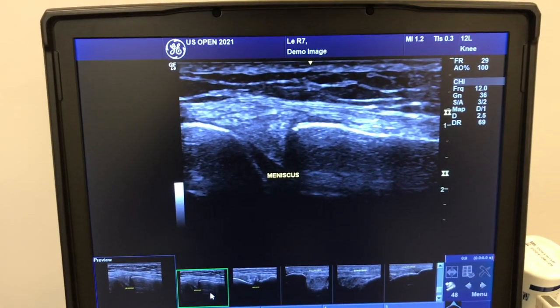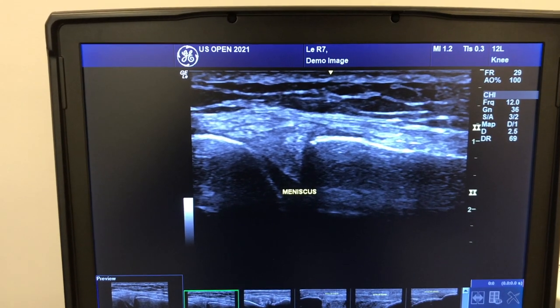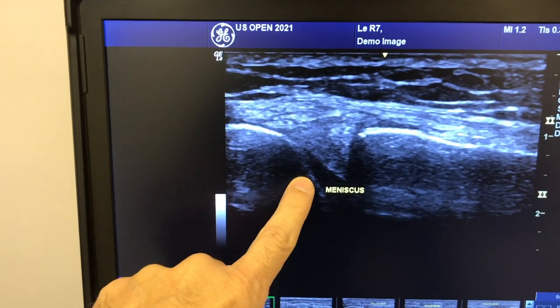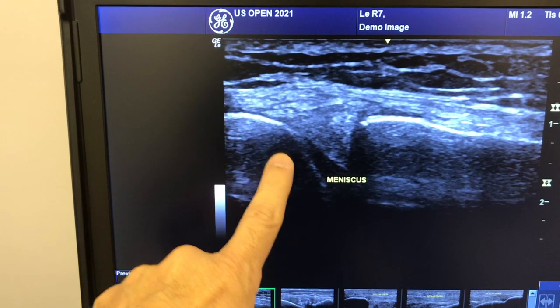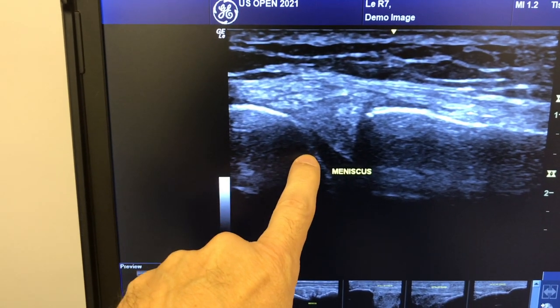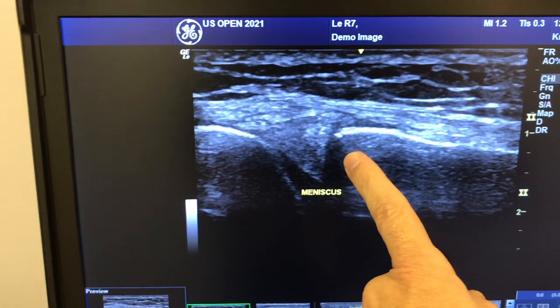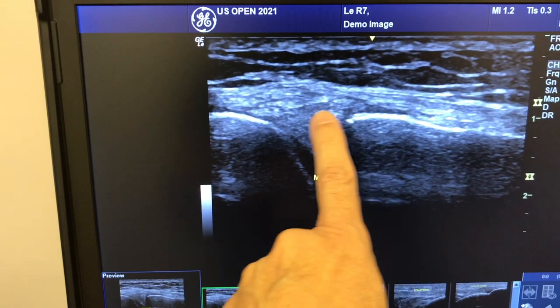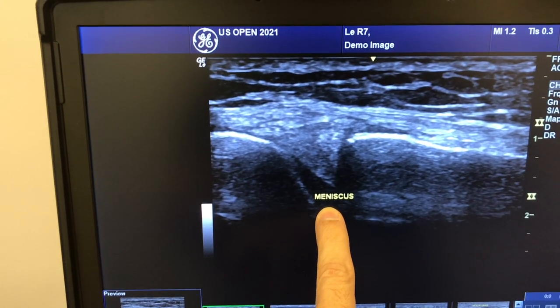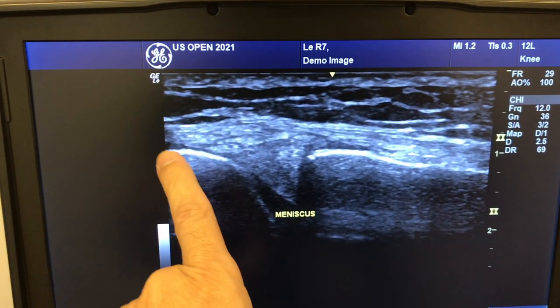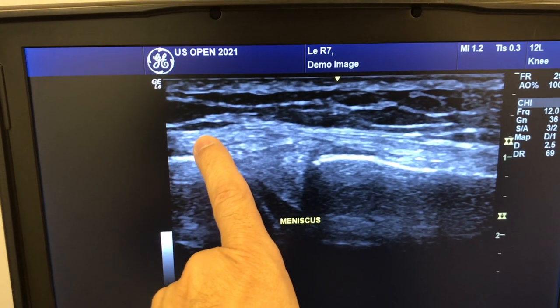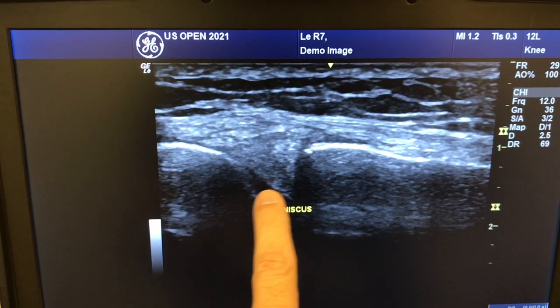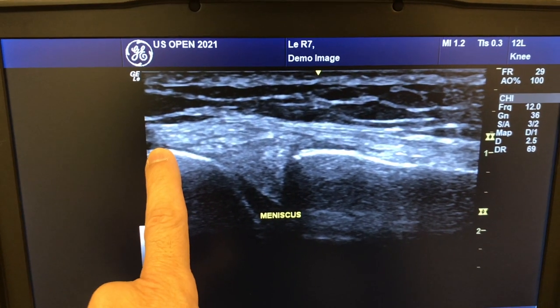Right here we have a longitudinal ultrasound image of the medial aspect of the knee. On the left side of the screen we have the medial femoral condyle shown by this bright line, and on the right side we have the tibia. In between, we have a triangular region of high echoes which is the cross-section of the medial meniscus, and above it we have very organized parallel echogenic lines which constitute the medial collateral ligament. So this is a healthy medial meniscus and healthy medial collateral ligament.